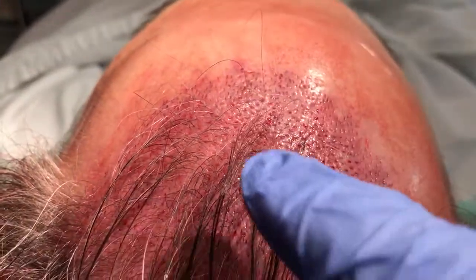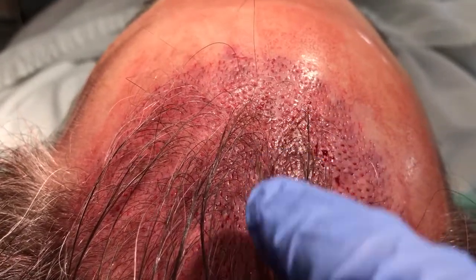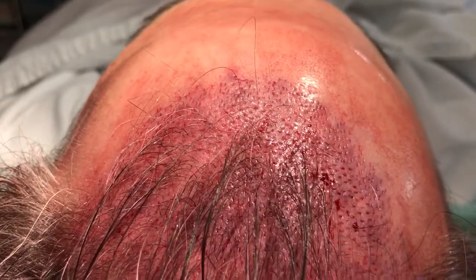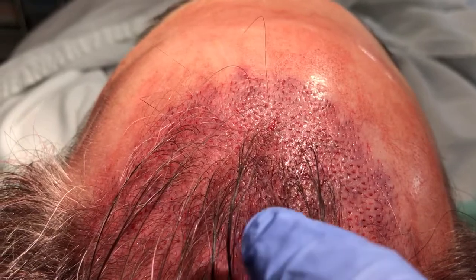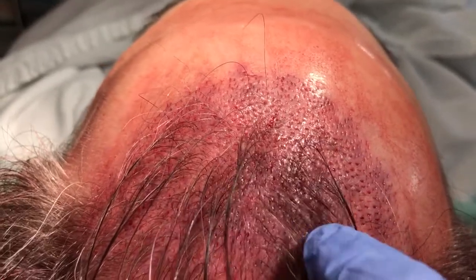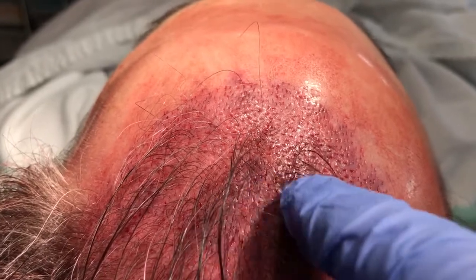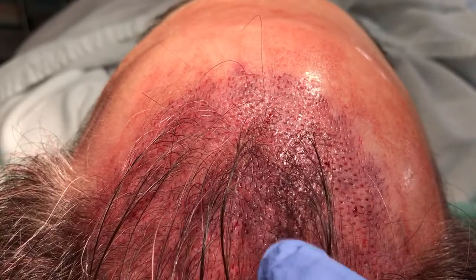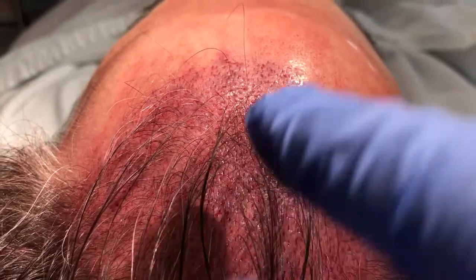As we go back here, the 3 hair grafts are made with sagittal sites. You can sort of peek in there and see that. There are several reasons here. The biggest reason that I've made sagittal sites in this posterior forelock region is that this area has hair, as you see. When you do coronal sites here, there's a risk of transection, in other words, cutting these hairs and losing these hairs. So I can create a denser result with sagittal sites by placing them much tighter in this distribution across this area.